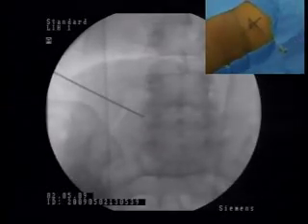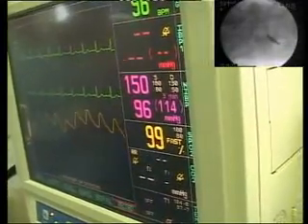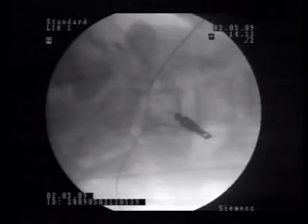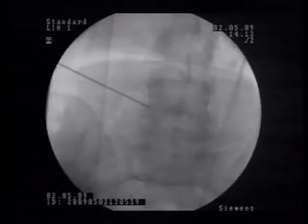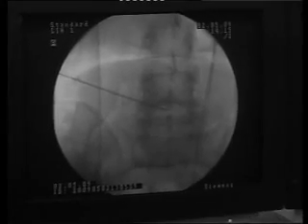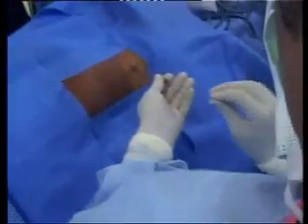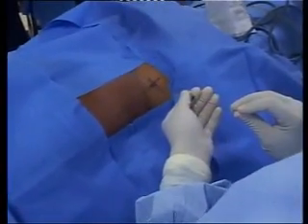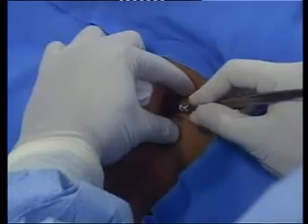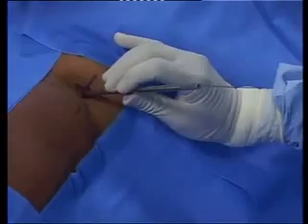We anesthetize the skin and put the needle in the foramen, then maneuver the needle under C-arm so that it comes into the disc. The patient is monitored throughout the procedure. The needle is positioned in the posterior quadrant of the disc and seen in the center of the disc on the AP picture. We then remove the stilet, pass a guide wire, remove the needle, and the guide wire is used for passing all instruments later.